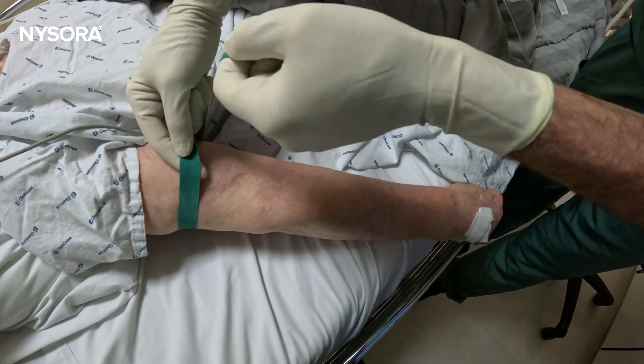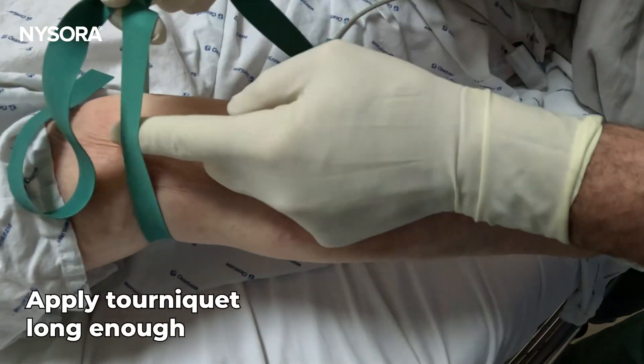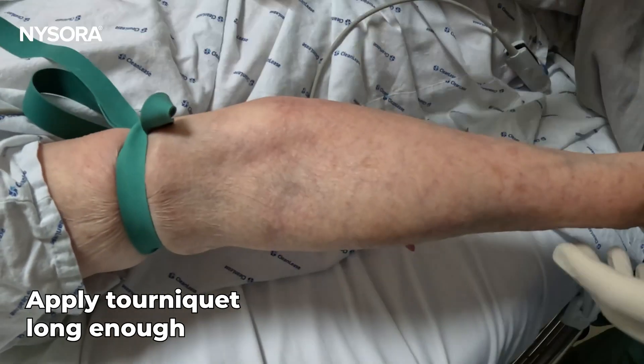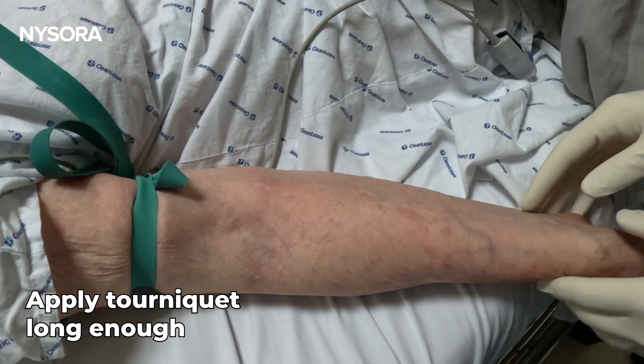Tip number one: apply the tourniquet and wait long enough to allow the veins to fill. Patience is the key — rushing can compromise the already delicate veins.